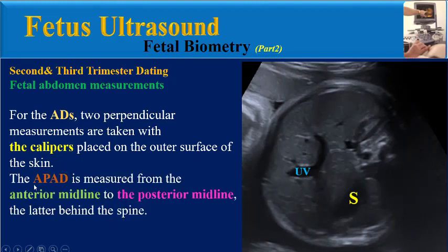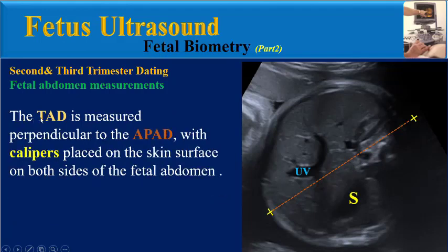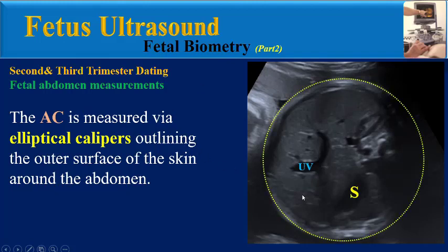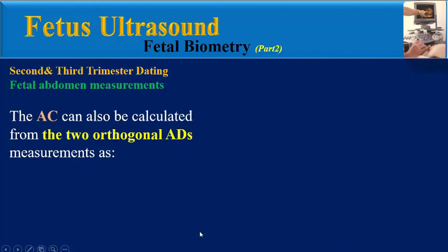For the abdominal diameters, two perpendicular measurements are taken with calipers placed on the outer surface of the skin. The anterior-posterior abdominal diameter is measured from the anterior midline to the posterior midline, located behind the spine. The transverse abdominal diameter is measured perpendicular to the AP diameter, with calipers placed on the skin surface on both sides of the fetal abdomen.